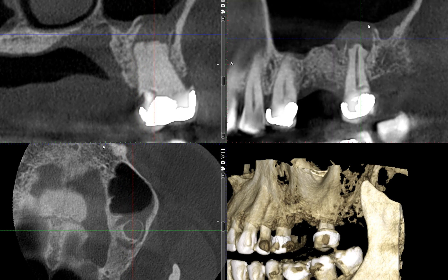Not only that, it may have perforated the maxillary sinus, as we fail to see the continuous corticated outline of the floor right here.